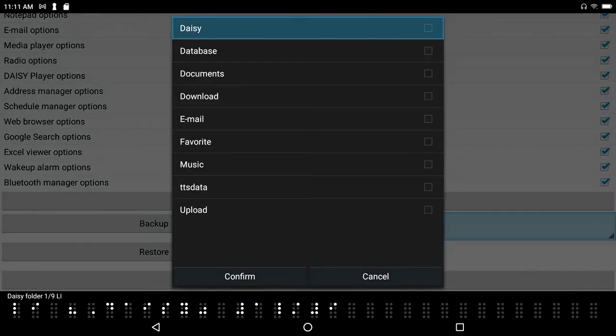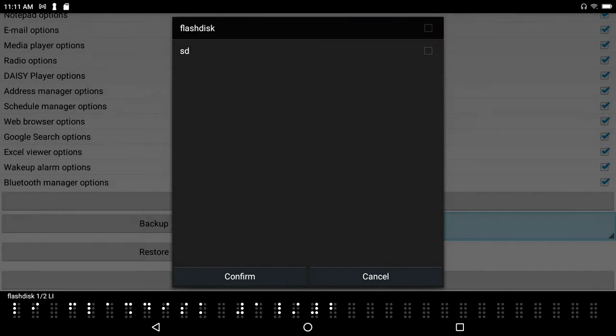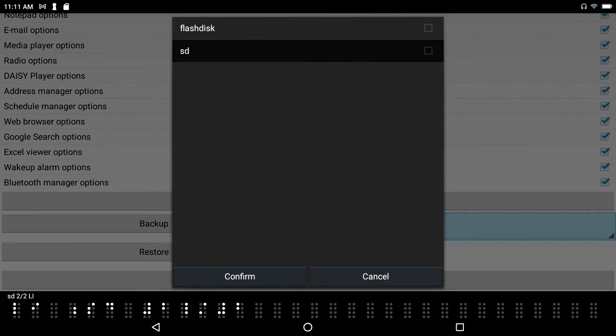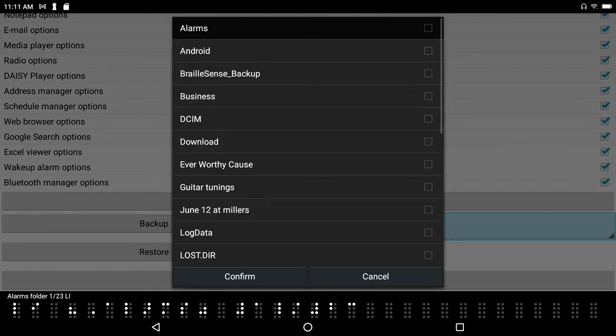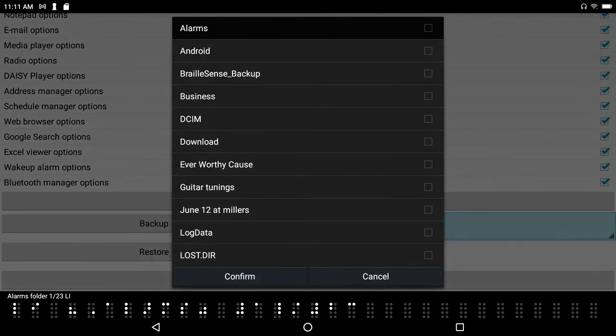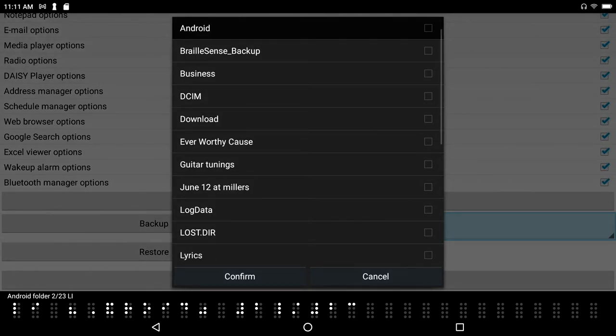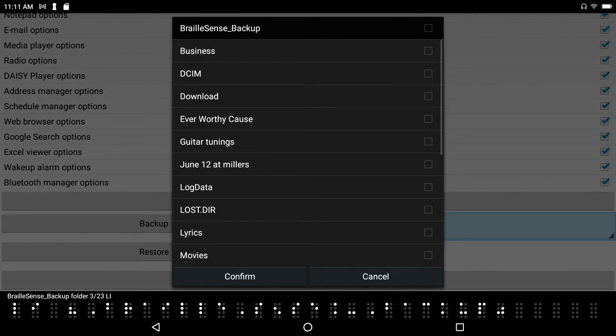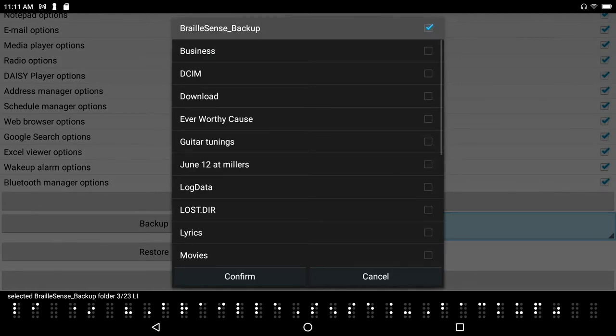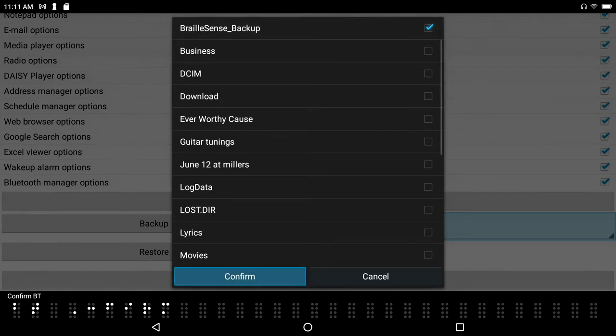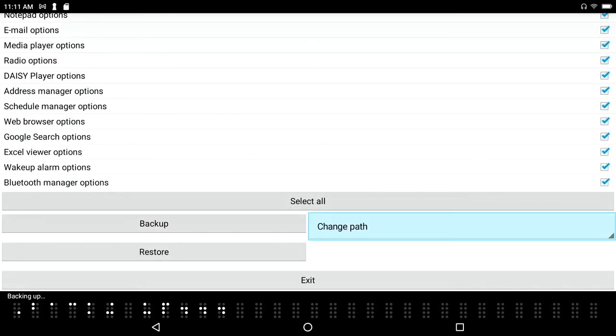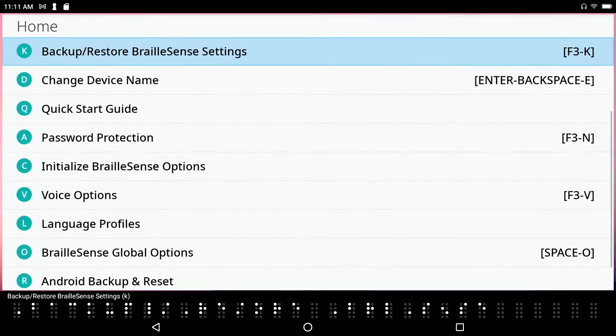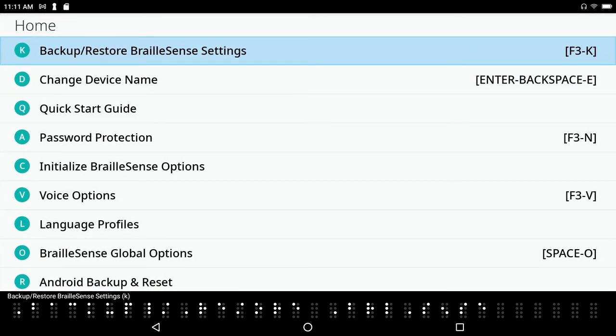Select backup folder dialog, daisy folder. And now I'm going to press backspace - there's my flash disk, there's my SD card. Let's say that I want to go ahead and backup: Android folder, BrailleSense backup folder. There's my BrailleSense backup folder. I'm going to press space on that, selected BrailleSense backup folder, and I'm going to simply confirm. Backing up, and now it says it's backing up and it is already complete.